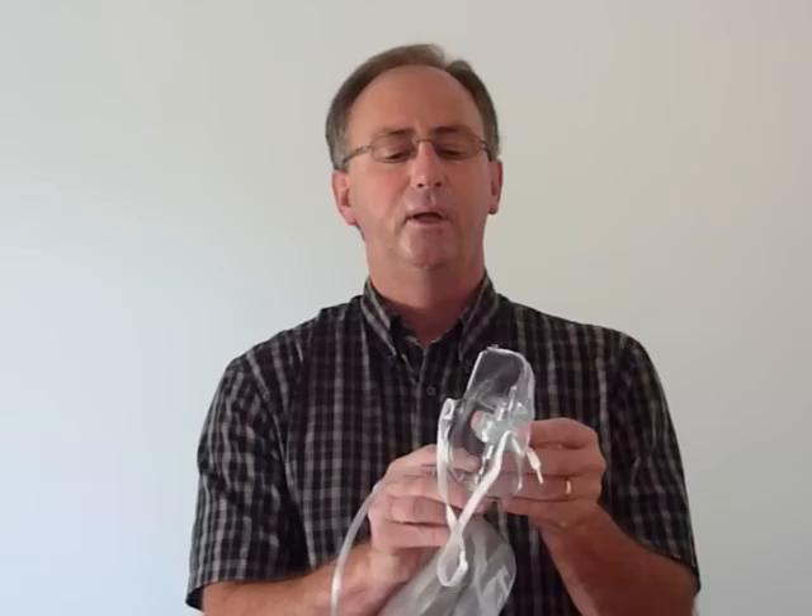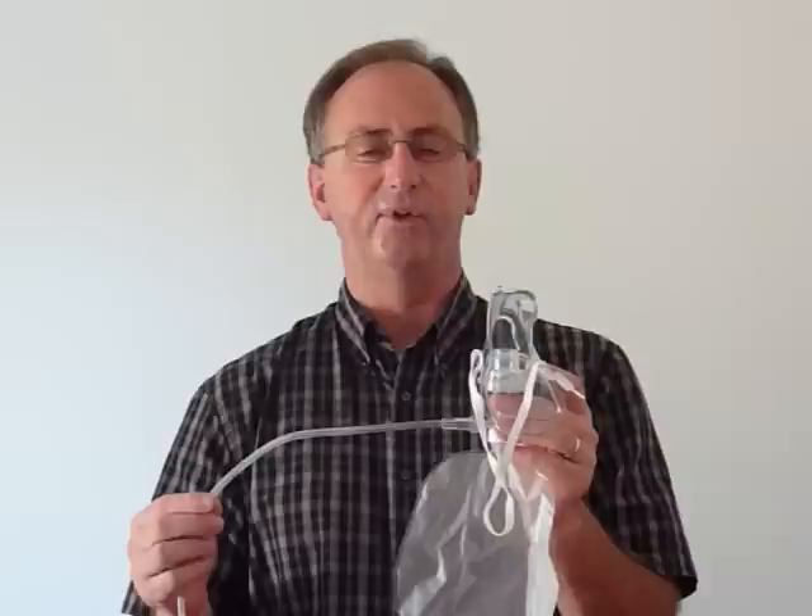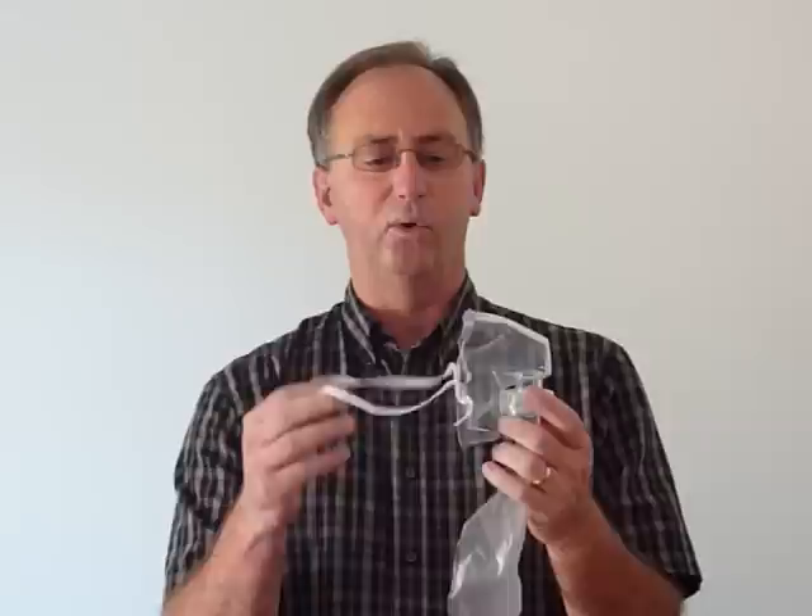Next, you determine that the patient needs some oxygen. So you connect the bottom piece and connect your oxygen delivery source. If you need it at low delivery, that's zero to six liters per minute. If you need it at medium concentration, you set it from six to ten liters. And at high concentration, ten to fifteen liters per minute.